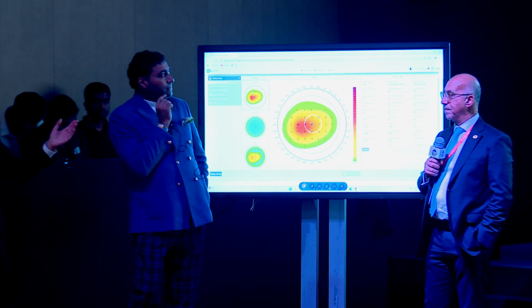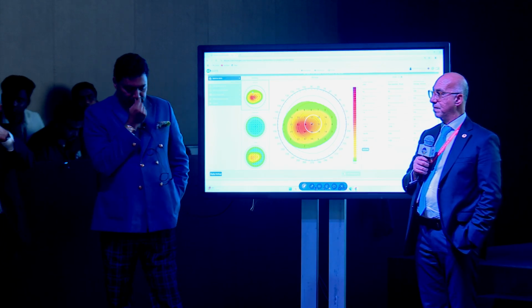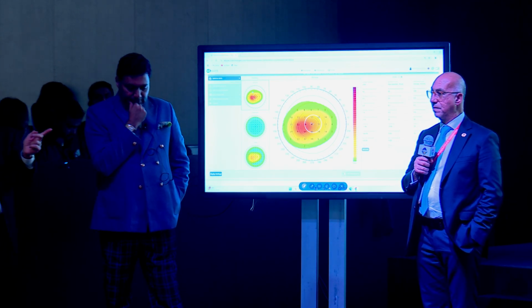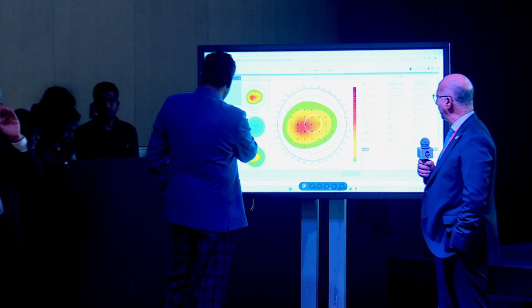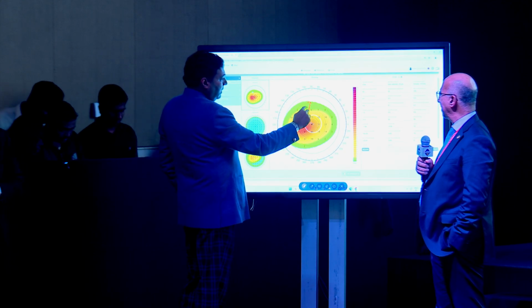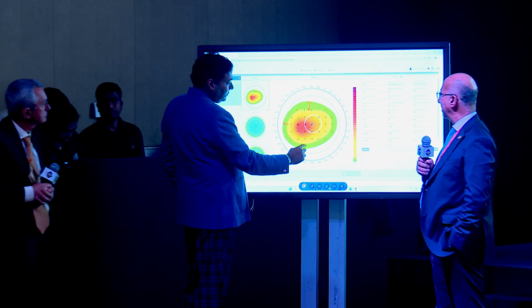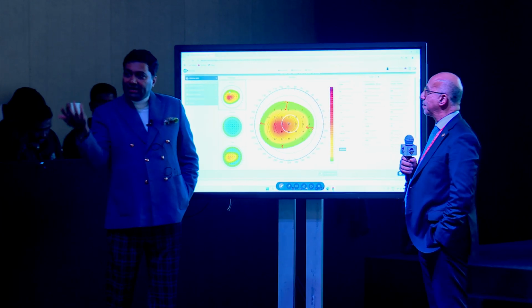So again, making a very narrow refractive zone and giving a constant, very smooth gradient in radial direction, it will allow the epithelium to find a homogeneous effort to regrow in a homogeneous way in all of the radial directions. And you can see that the transition zone is different in different sizes. That allows the epithelium to heal.